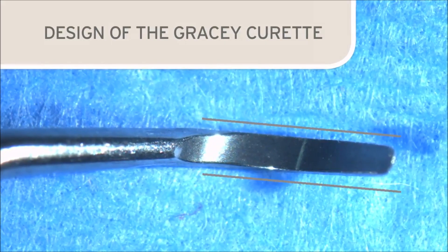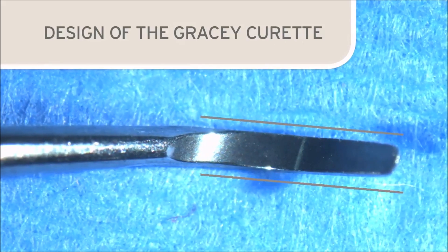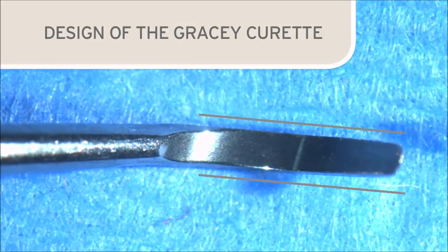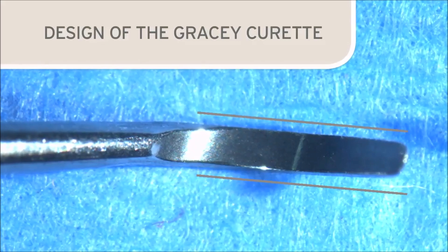Close inspection shows that the lower cutting edge is parallel to the non-functional edge of the Gracey. It is just lower due to the 70-degree angle of the blade. This is important to remember in order to retain the original blade design when sharpening.